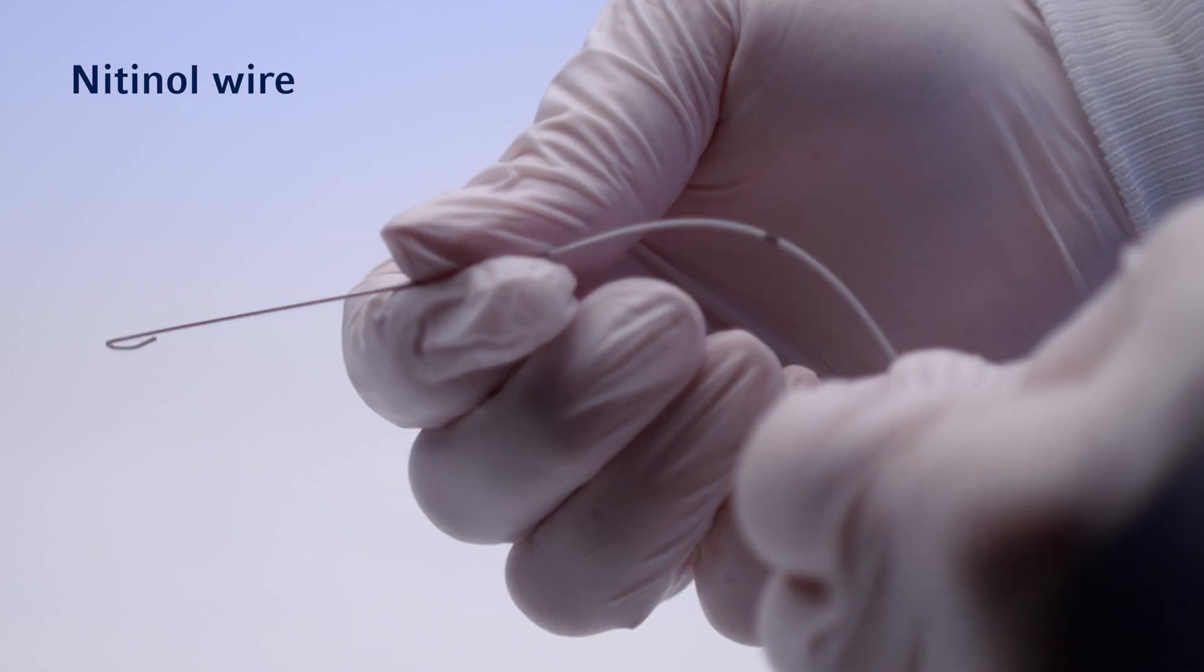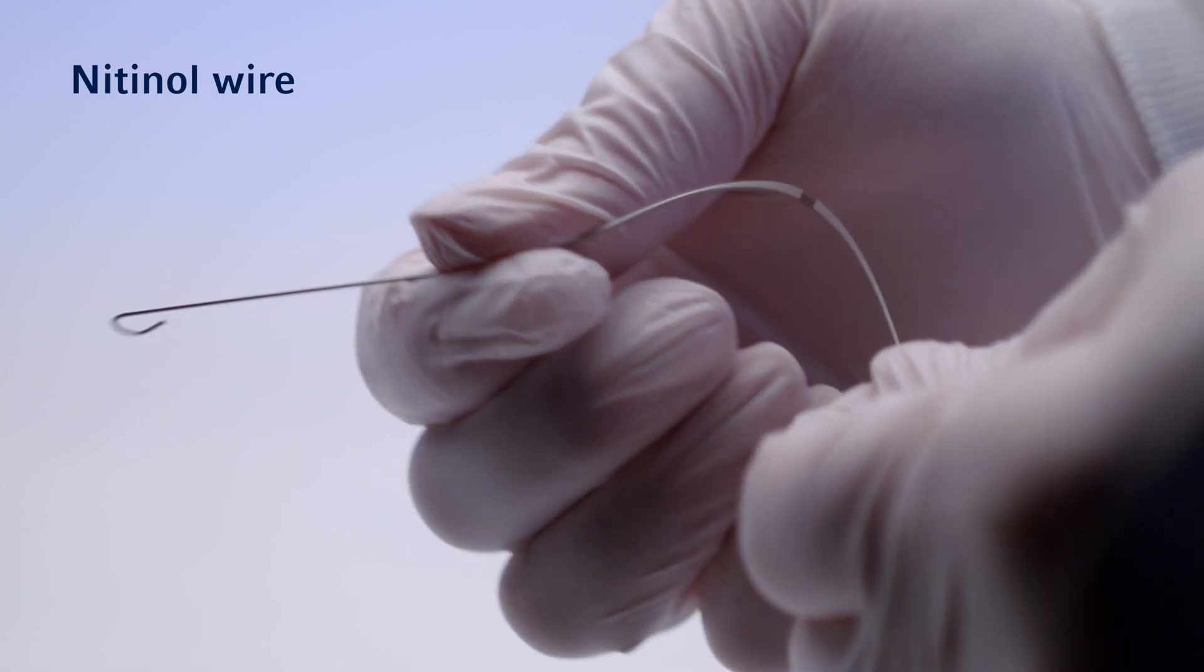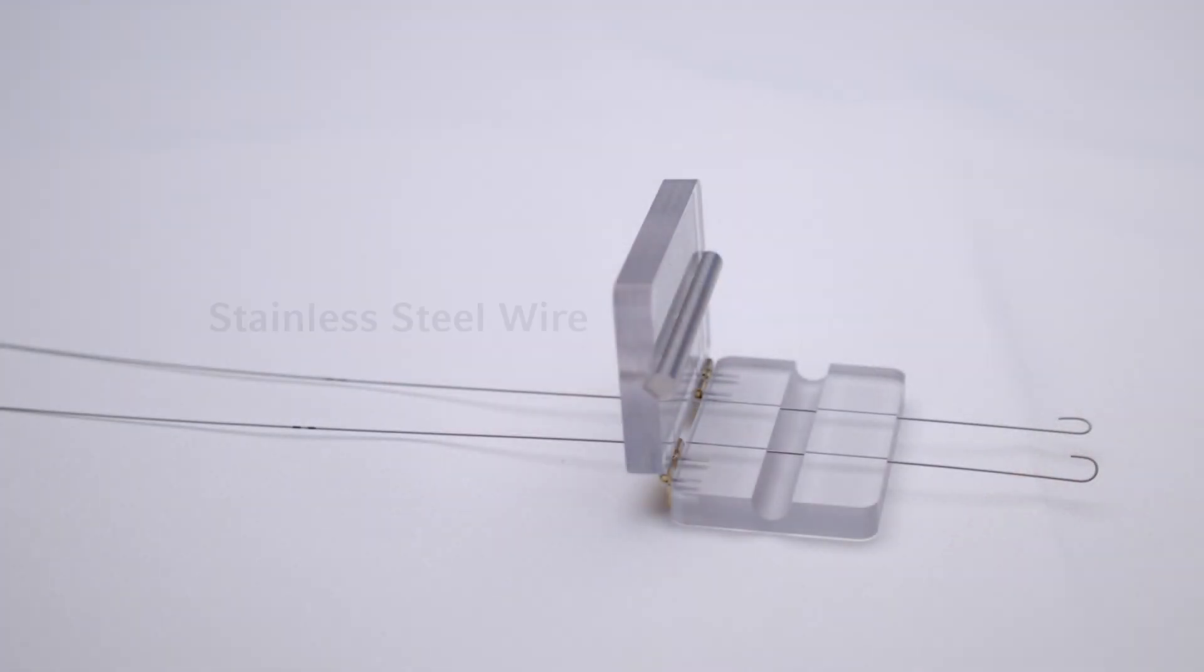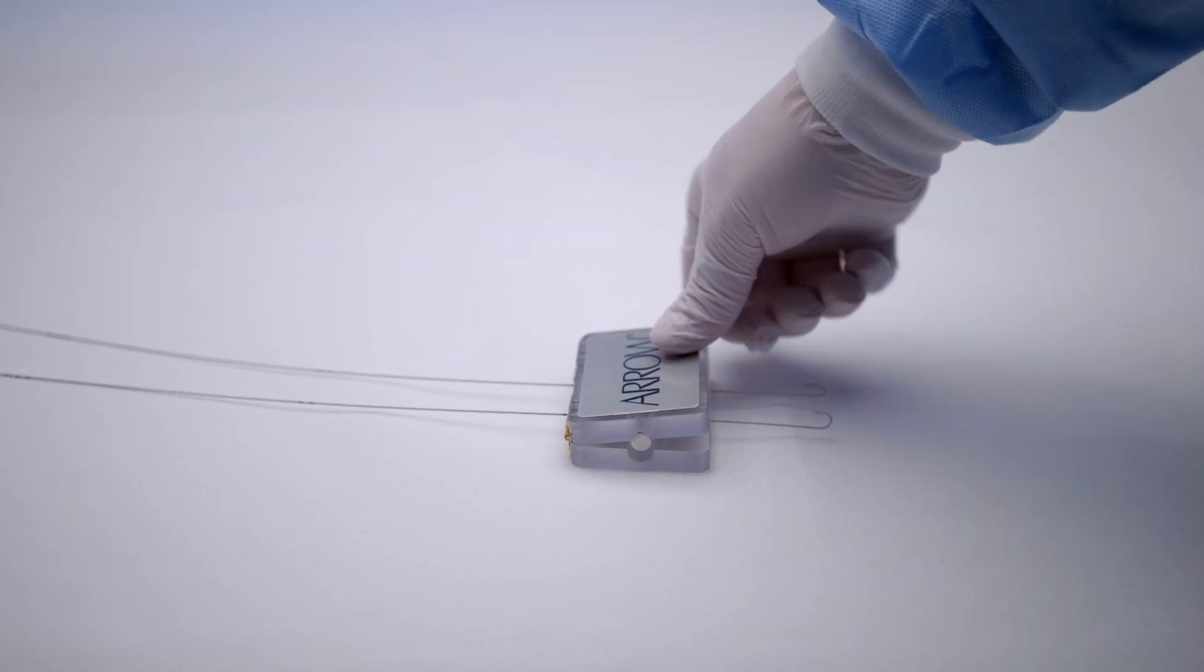Nitinol, with its shape memory and super elasticity, is designed to allow flexibility around a tortuous path. The kink resistant properties of the Nitinol material allow for improved catheter insertion compared to stainless steel guide wires.